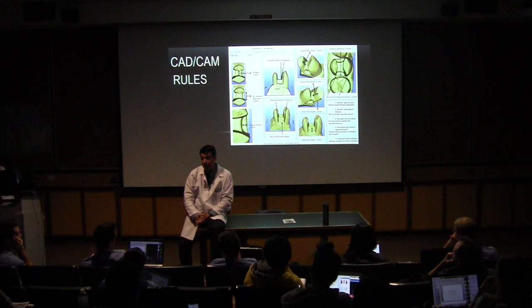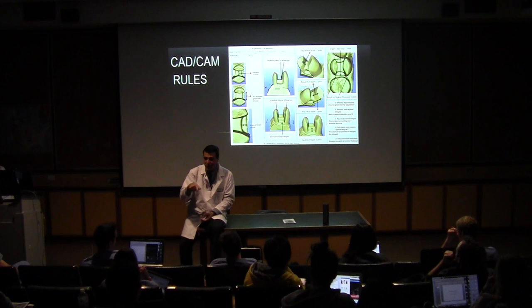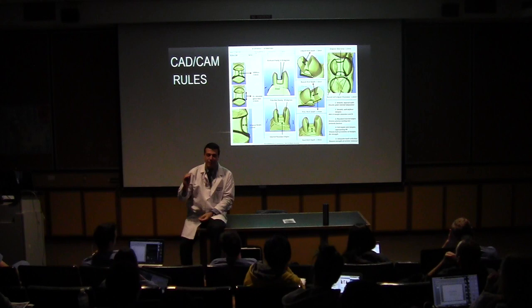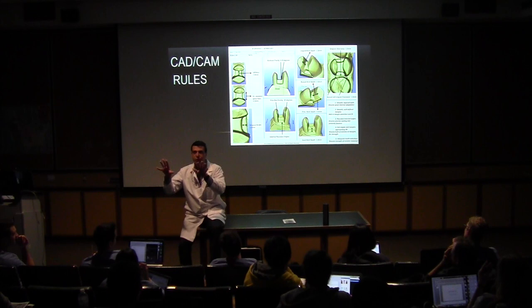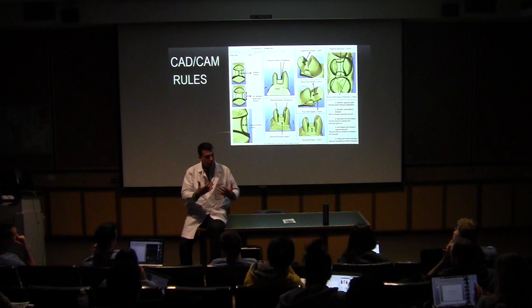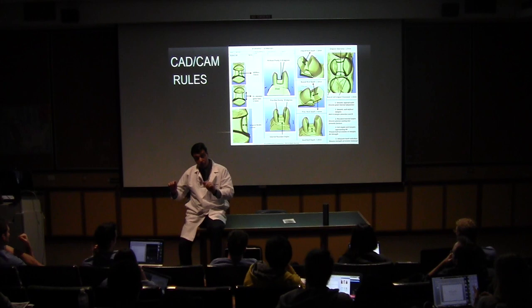Divergence, right? Why? Because if you have an undercut, in a regular lab case there is no way you can take an impression and send it to the lab. The lab technician is going to call and say, doctor, I'm sorry, there's no way I can make that restoration. Call your patient back and finish that prep better. I hate that situation. When my lab guys call me, I'm furious. It is kind of embarrassing because I'm the doctor and he's the lab guy. I'm not depreciating the profession, but I'm in charge. So I'm going to do a perfect job so the lab guy won't call me. I really respect the lab people I work with, and when they call, I respect their opinion and say, my apologies, I'll fix the prep, take a new impression and send it back.